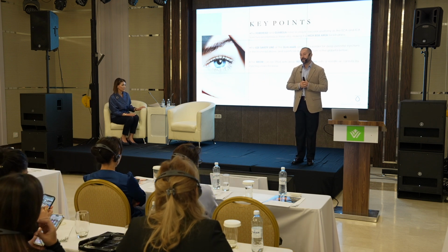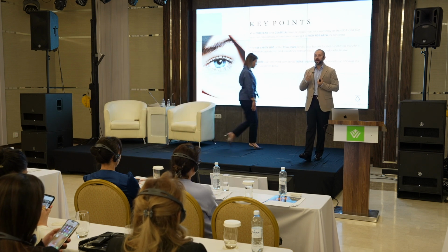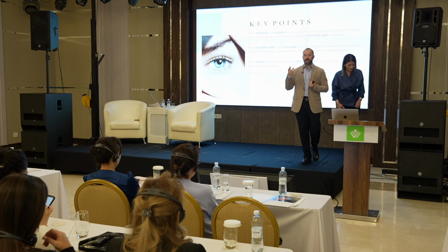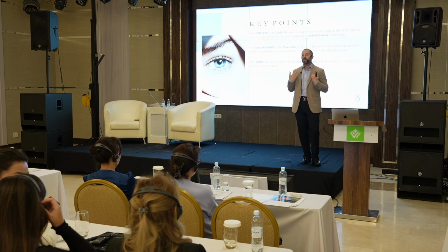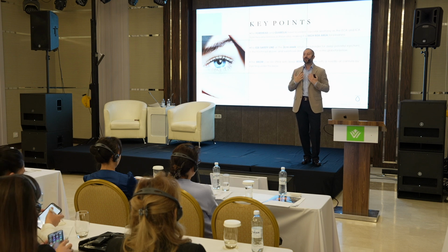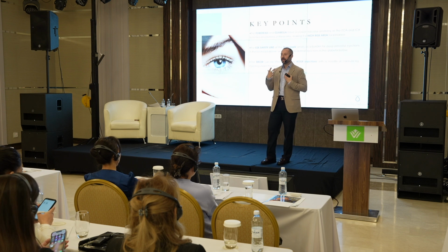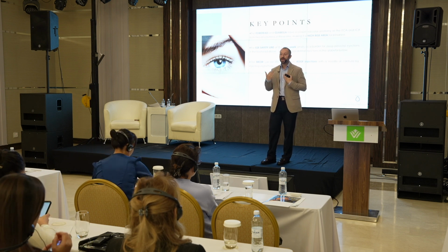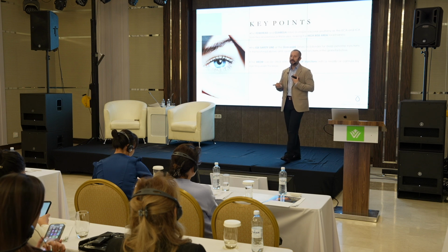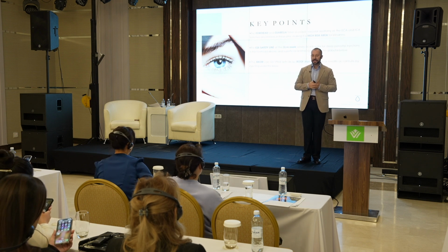Please don't trust your aspiration. Be careful about the low pressure. Don't push product fast. When you aspirate, if it's negative, you think that you are not inside the vessel, you can inject more, more pressure, more fast. Be careful, you can still be inside the artery even if your aspiration is negative, it's high. That's why it's really important.